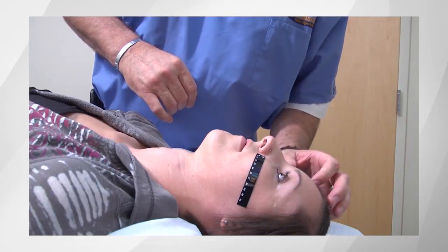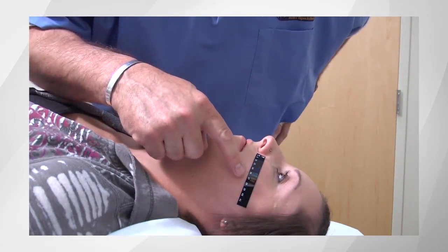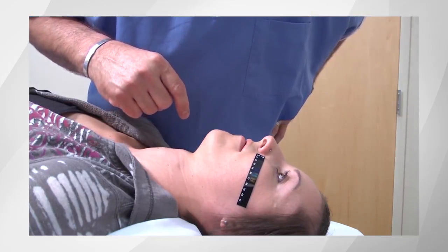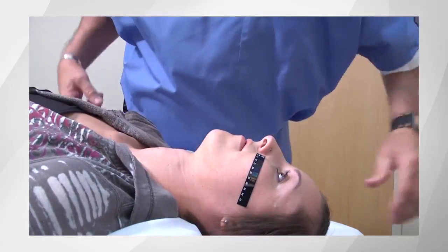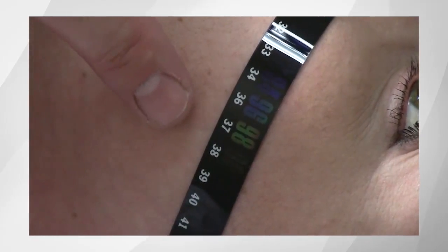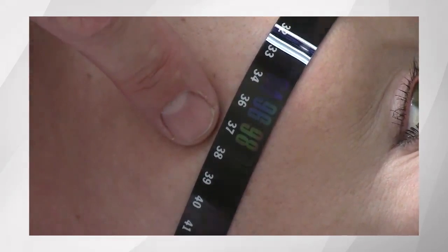The practitioner begins to assess the physiologic markers of successful procedural application. These include 1. Tearing from the lateral canthus, 2. Conjunctival redness, and 3. Most importantly, a 3 to 5 degree temperature increase as shown on the microcrystalline temperature strips. Documenting the temperature increase is essential to demonstration of a properly performed procedure. It will also provide proper billing-related validations.